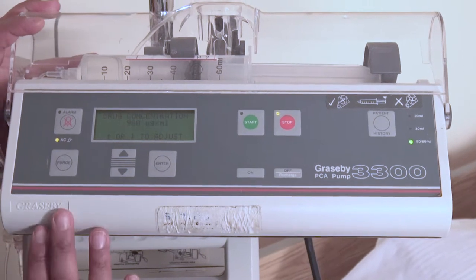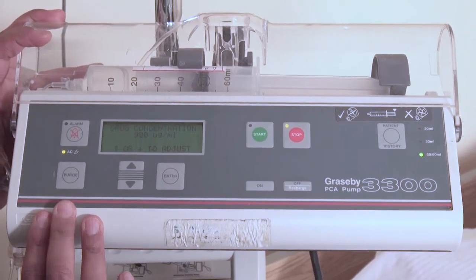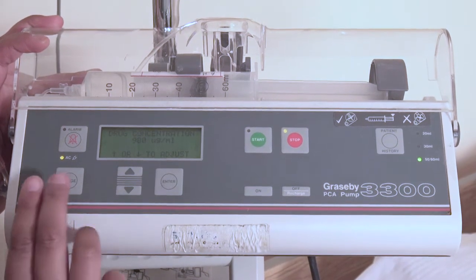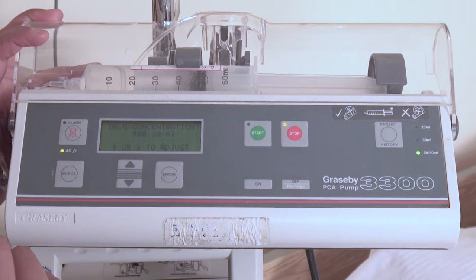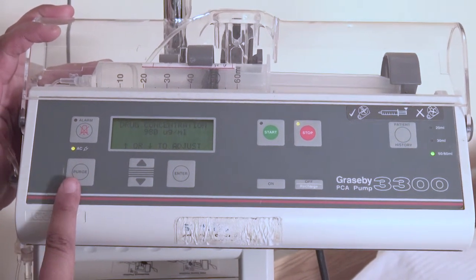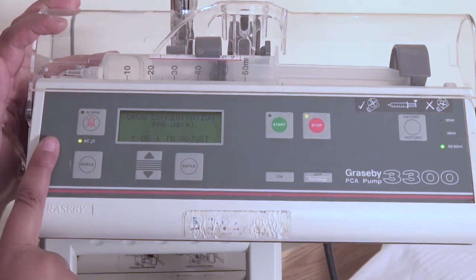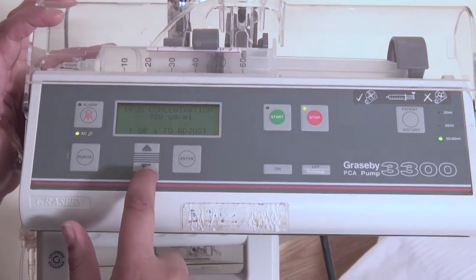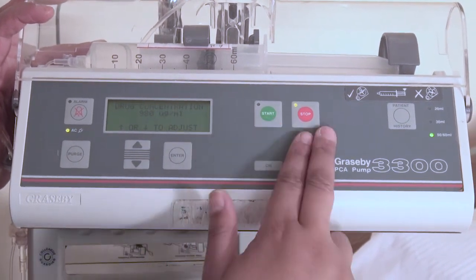This is one of the PCA pumps that we use, and I just want to show you a little bit about it. You have your purge button, which is like a quick flush or a quick prime, which I don't tend to use very often because you have to be very careful about it. Alarm is if it's alarming, you can silence it. Your up and down to toggle up and down, enter to press OK, and then start stop.